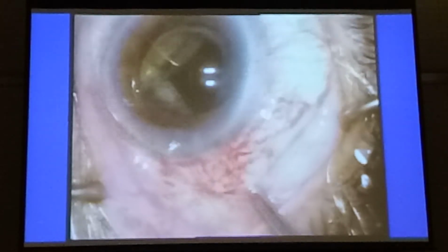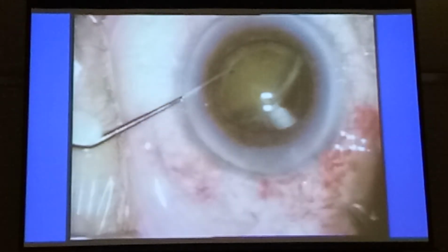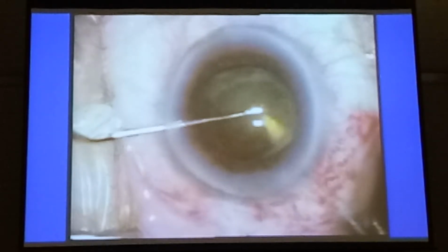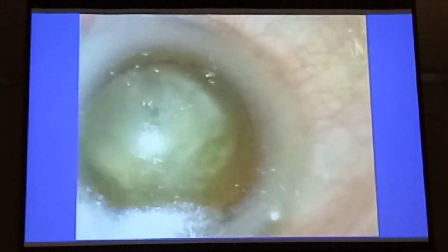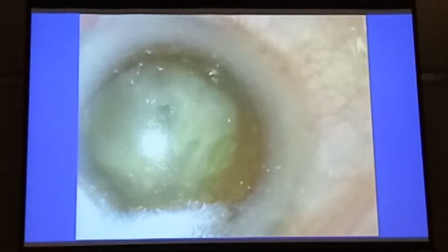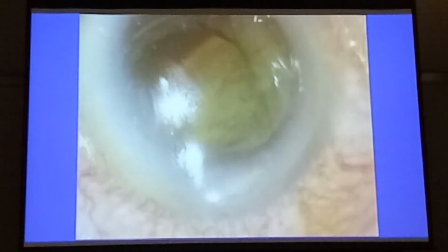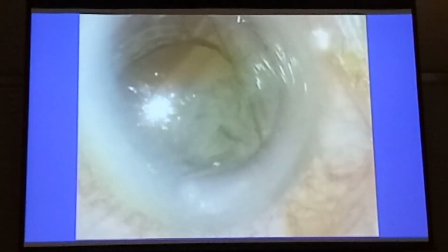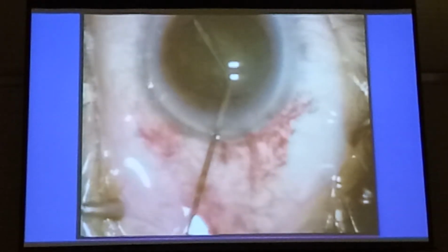And again, when the nucleus drops, most of the time you can actually put in a needle to do posterior assisted levitation. I wouldn't use a 20 gauge needle, because I think it's too big. Probably a 25 gauge needle is good for posterior assisted levitation. Here's one more case for you, since you don't see this very often. So the message is just, during hydrodissection, be gentle. So watch this. Hydrodissection, there's the snap. And again, when this happened to me, and the nucleus is tilting, I'm telling my nurse, quick, get me my 25 gauge needle. Hurry up! But you know, when you want the nurse to be fast, they are very slow.